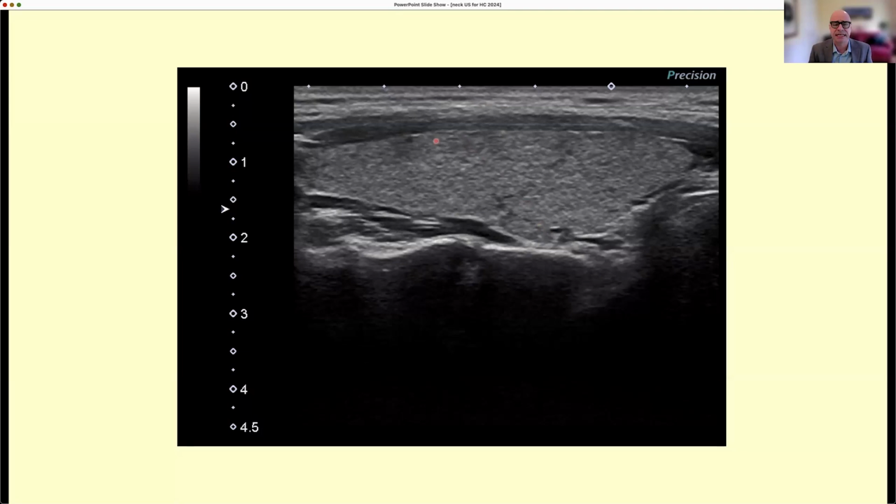And so you can see the thyroid, a difference with many other structures, it has this nice gray texture. This is a normal thyroid. Look, you can see it in the longitudinal view, and it has this nice gray texture. It is in the middle of the gray scale that is reported here, and it is exactly what the ultrasound does. Each one of these gray dots is a small interface, a normal large follicle hit by the ultrasound generated by the probe.